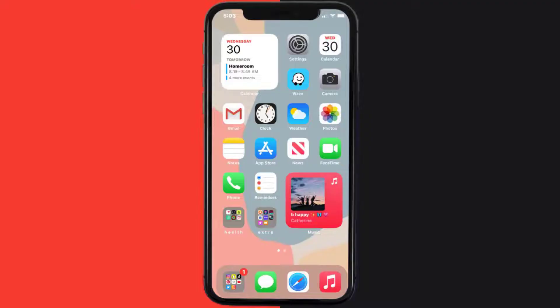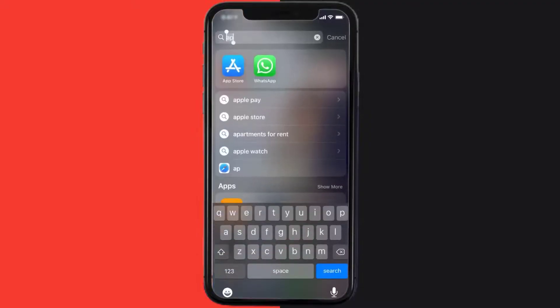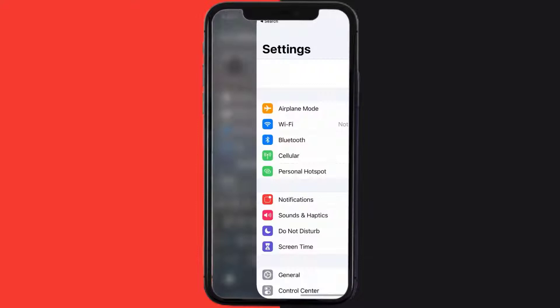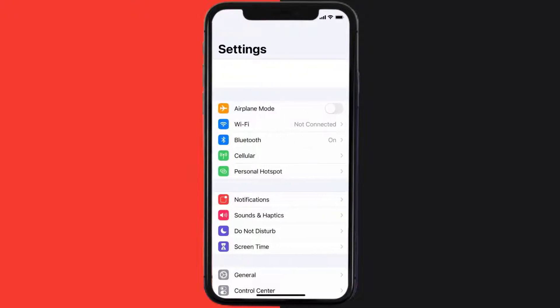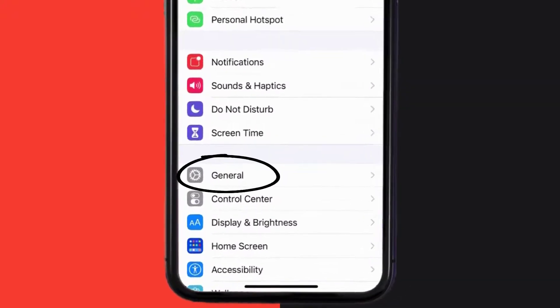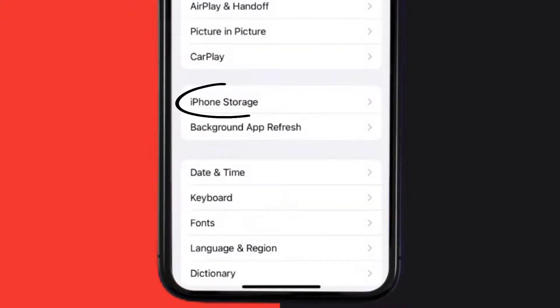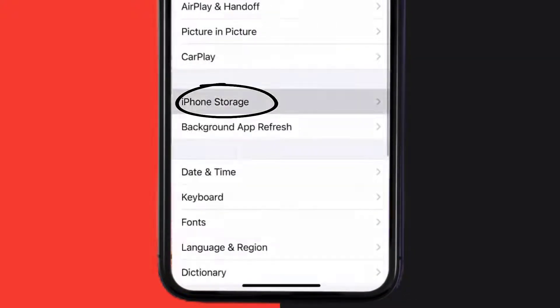But if you still encounter this issue, then you need to clear app cache. Go to your device settings, and then scroll all the way down to General, and tap on it. Then tap on iPhone Storage.